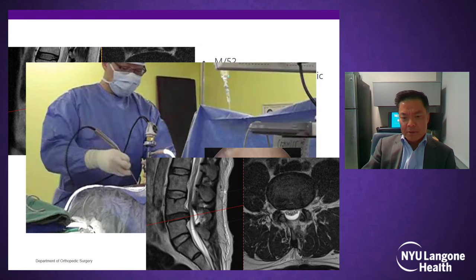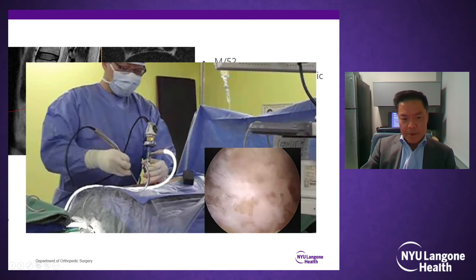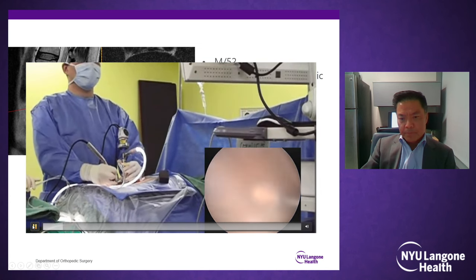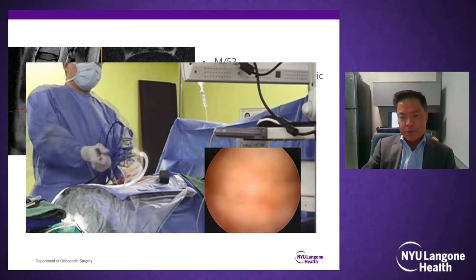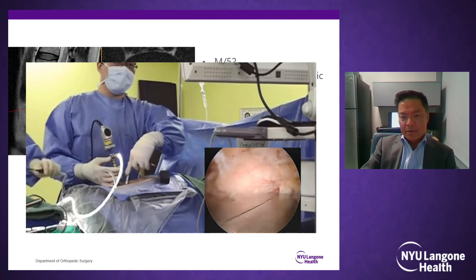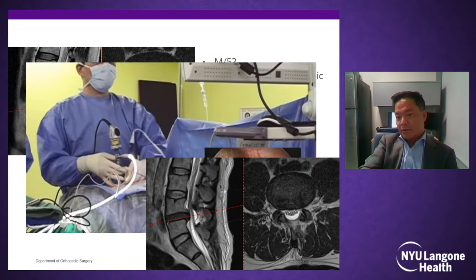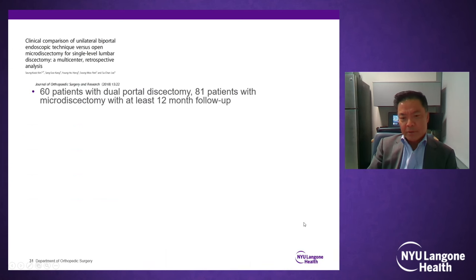Same thing. This one has a little bit better video. Again, the principle of the surgery is the same as open surgery. Take down the flavum, you take down the overhang of the lamina and the lateral recess. I just went to the, sorry, apologize. Okay, it is the same thing. So it is the next slide. So you can see the post-op opening.